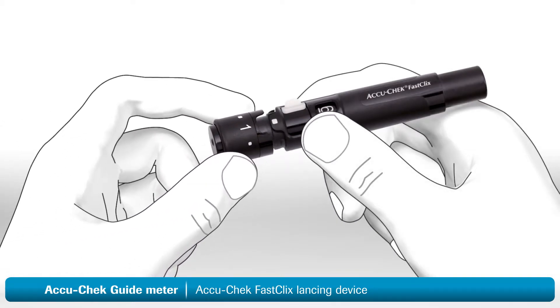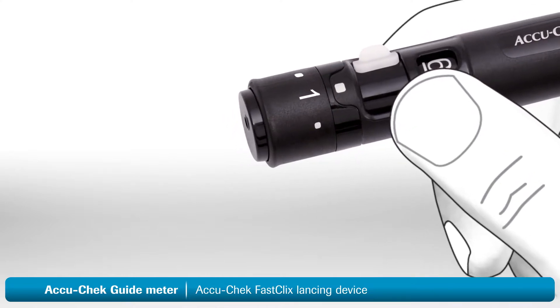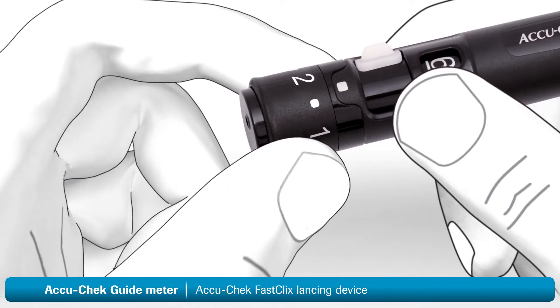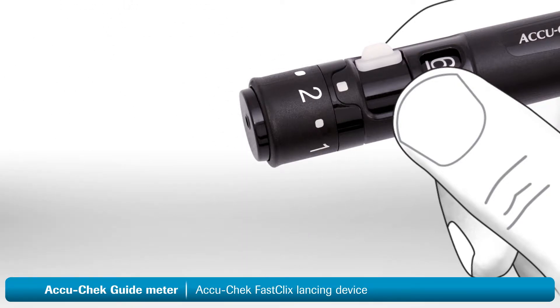Now place the cap back on the lancing device. The next step is to set the penetration depth to match your individual skin type. By turning the dial on the cap, you can select the depth of the lancet. Set the dial to 2 to begin with. You may need to adjust the setting a couple of times until you find the right level for your skin type.